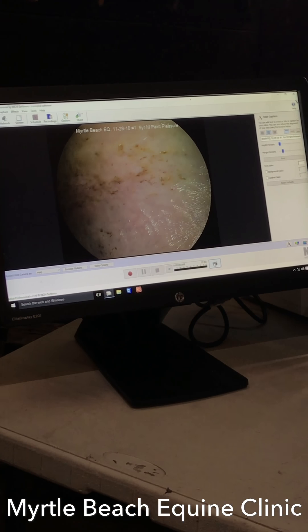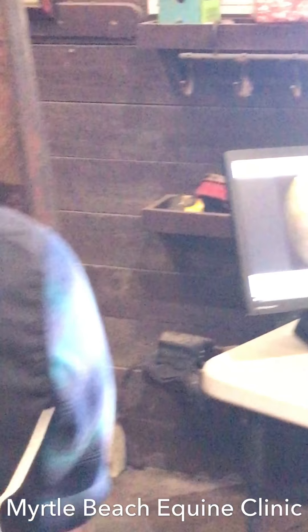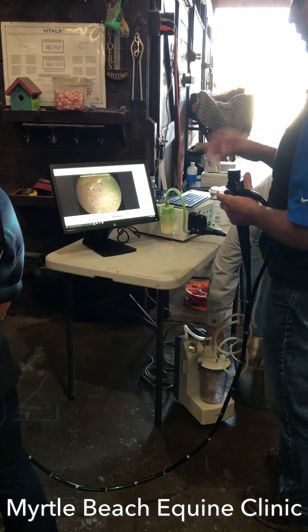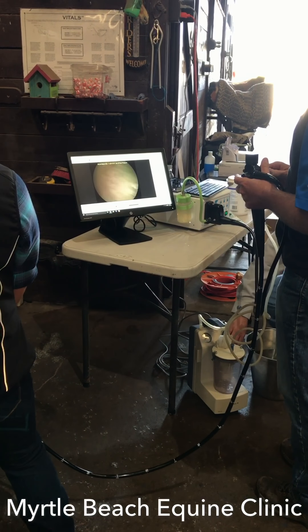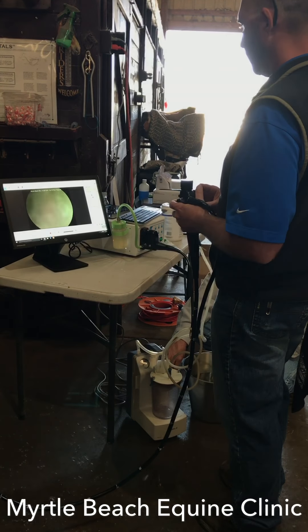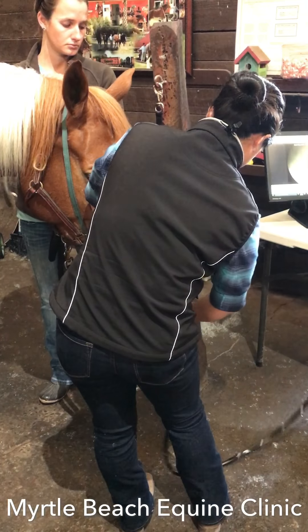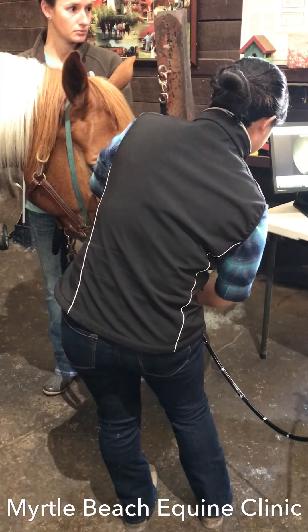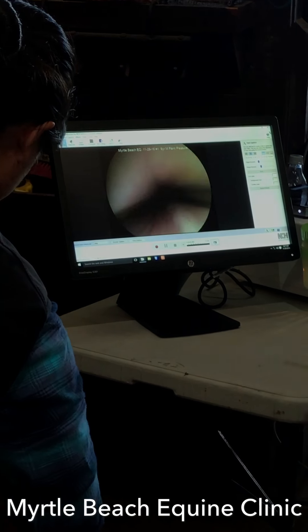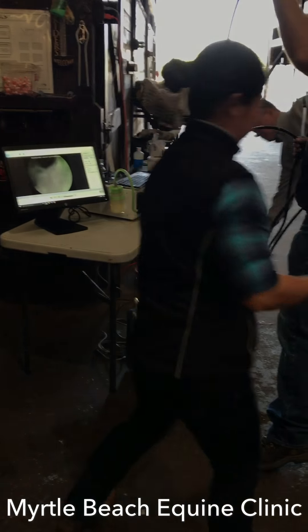Let's go ahead and deflate the stomach at this point. I look dorsal when I deflate, and as soon as I start to see fluid come into view I go ahead and turn that off and start pulling the tube out, because you don't want any big stuff stuck in there. Then what we'll do is go ahead and get some chlorhexidine first.